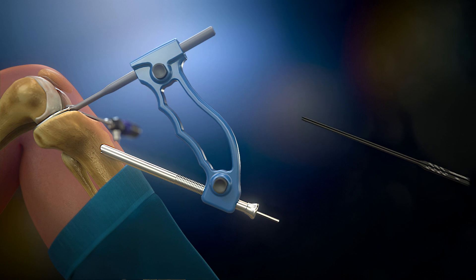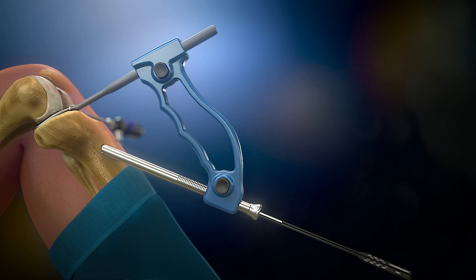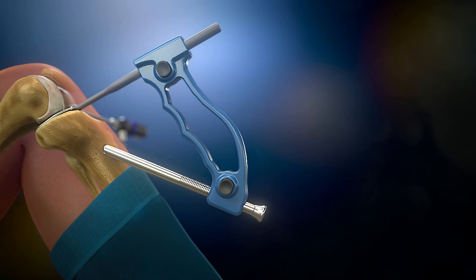The resulting length of the tunnel is measured with a depth gauge to determine the right size for the posterior screw. Then the Steinmann pin is removed and the aiming device is carefully kept in place to maintain the right direction of the drill hole.